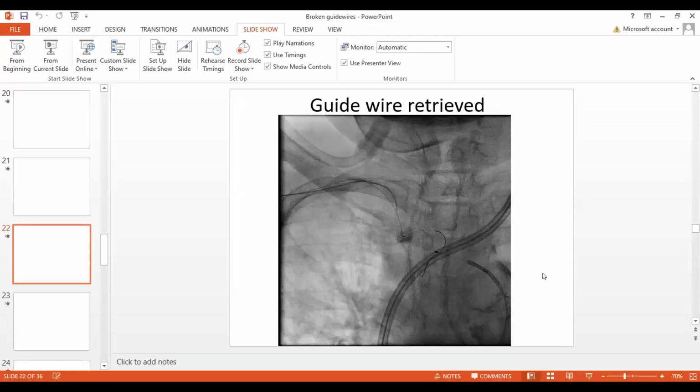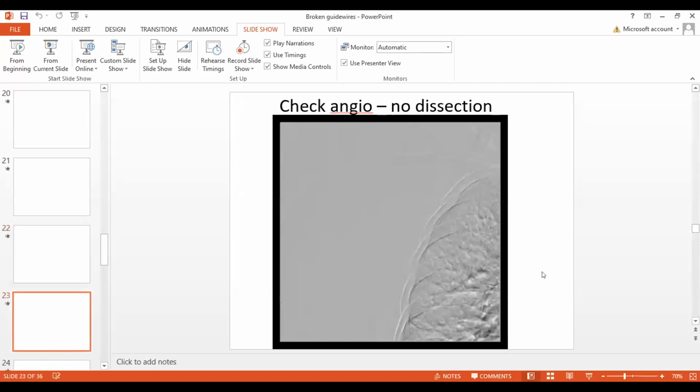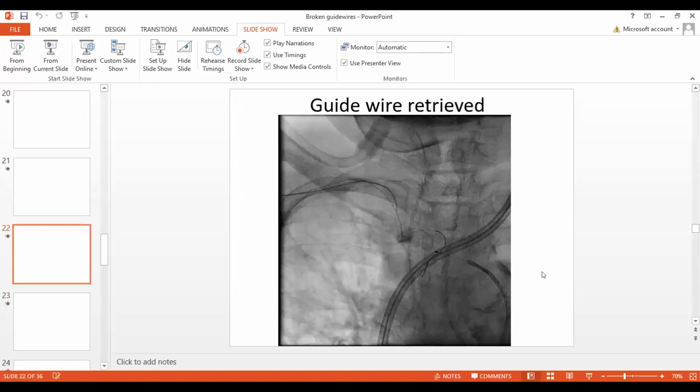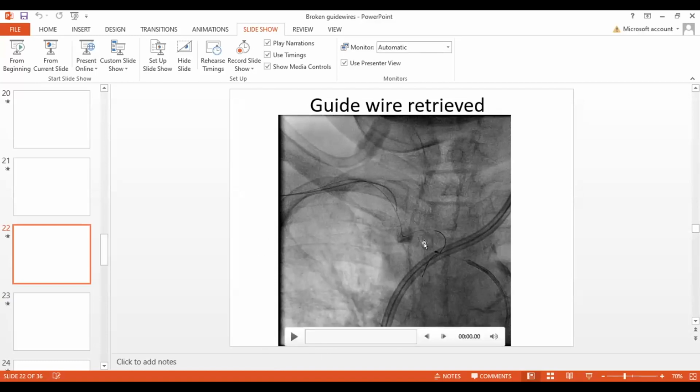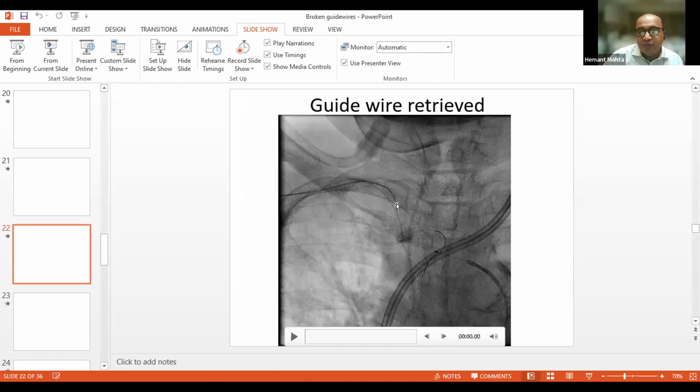Hemant, what is above your catheter? There is a device there. Is that coming here? In the subclavian? What is that? See, what had happened was, when we put the balloon, we had to put a wire. So that's the wire of the balloon. The wire of the balloon was parked all the way there.